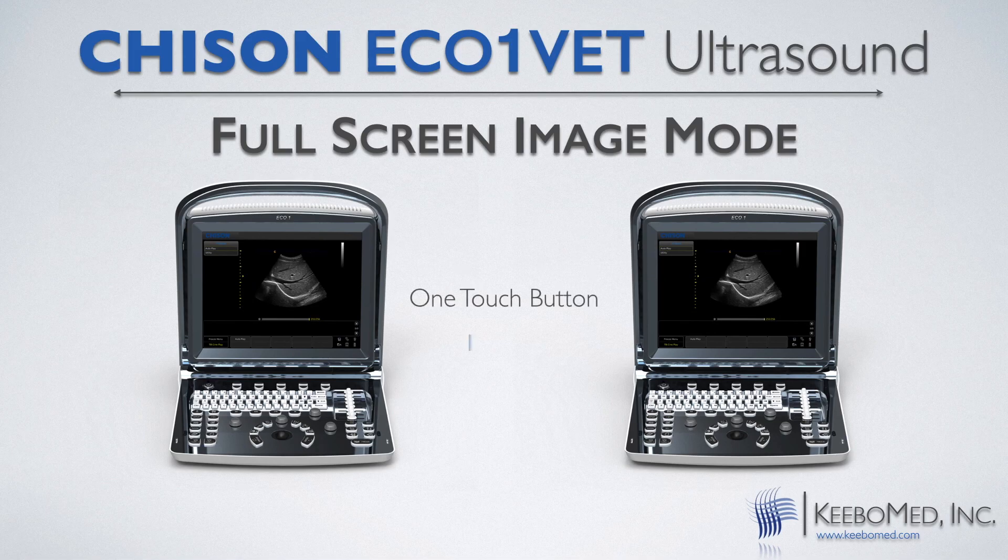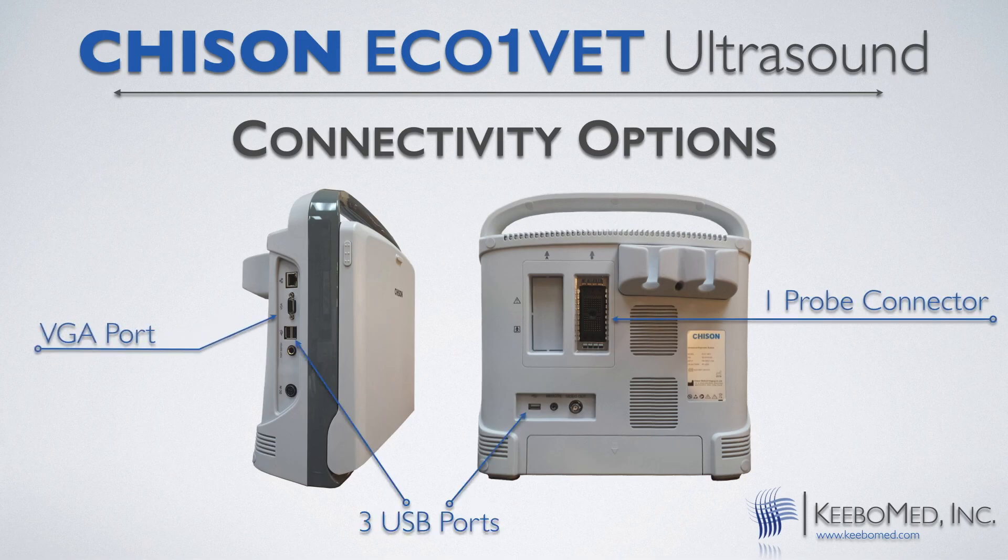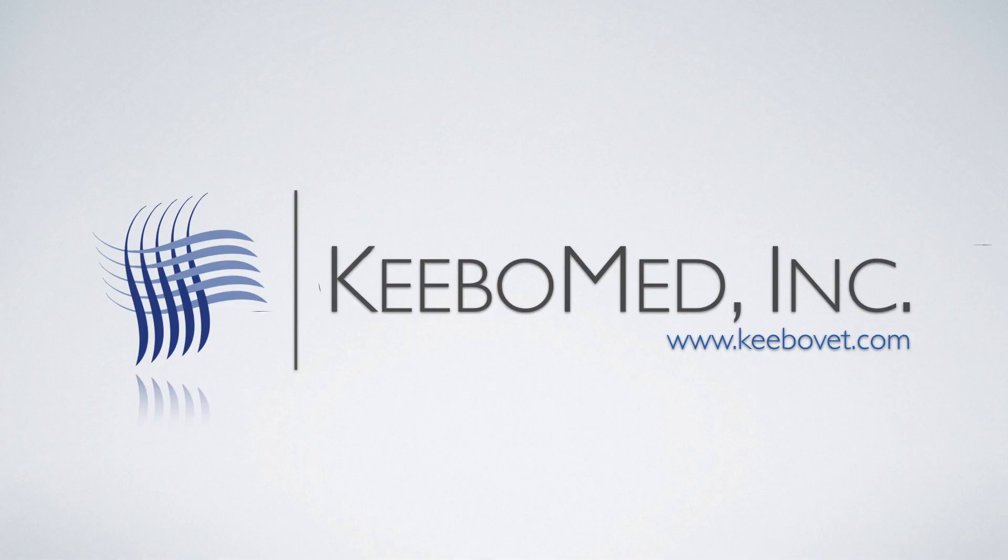Full screen mode lets you take full advantage of the 12 inch screen while scanning large and small animals. There are plenty of ways to connect to the ECO 1 Vet ultrasound. Get your ECO 1 Vet at KeeboMed today.